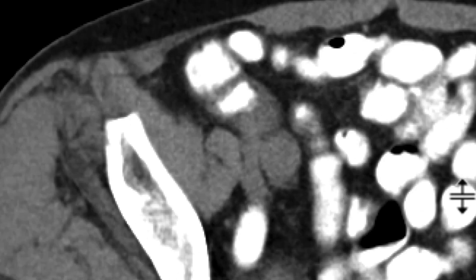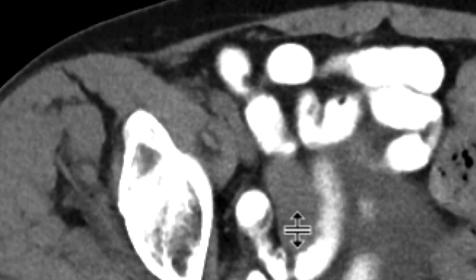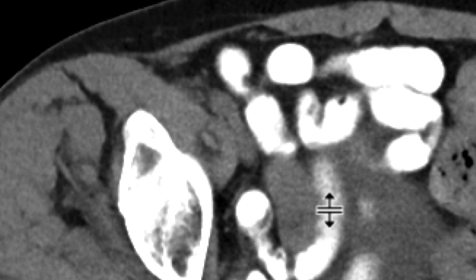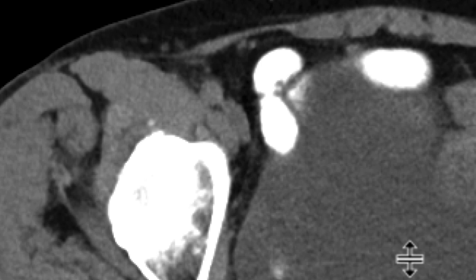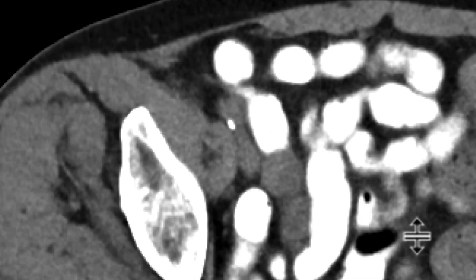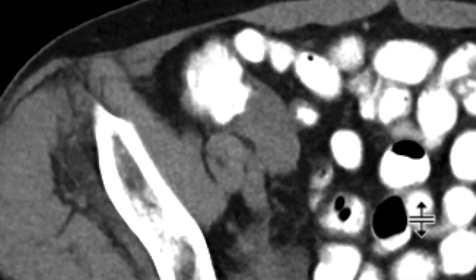We can follow it down. It's right over there, and we can see it all the way down — quite tubular and blind-ending. We can see that it's separate from loops of small bowel, which have oral contrast in them, and so we have this blind-ending tubular structure coming off the cecum.